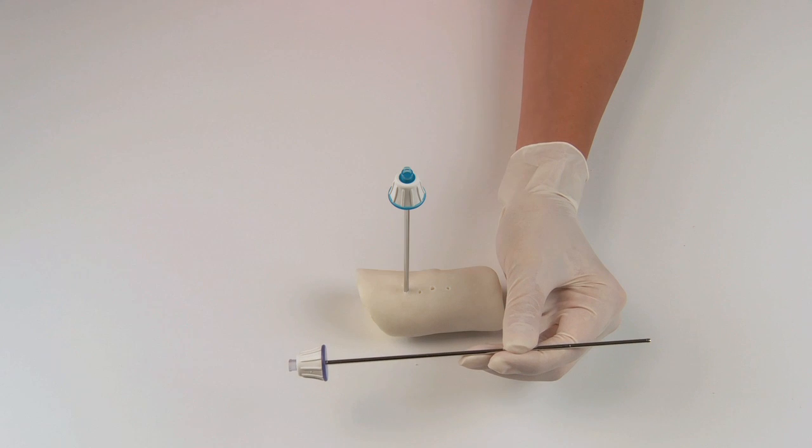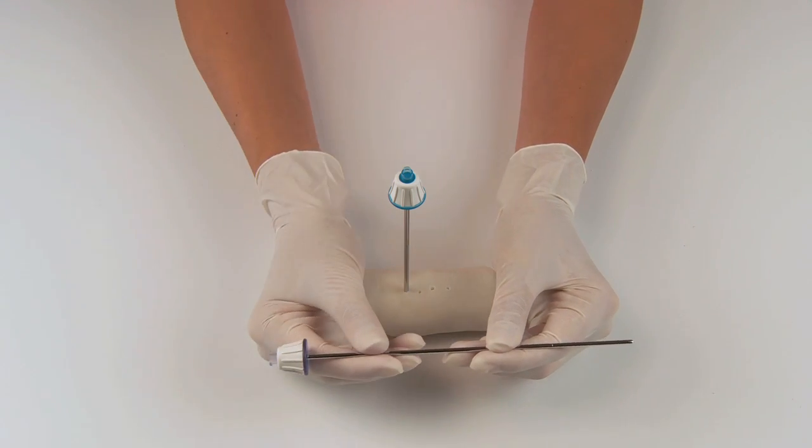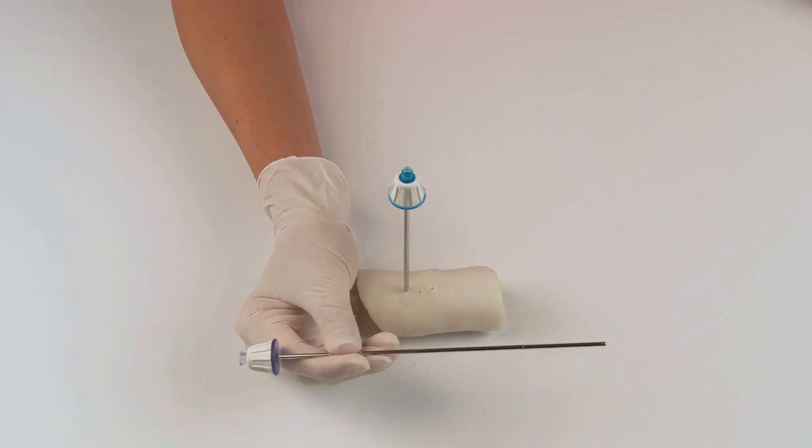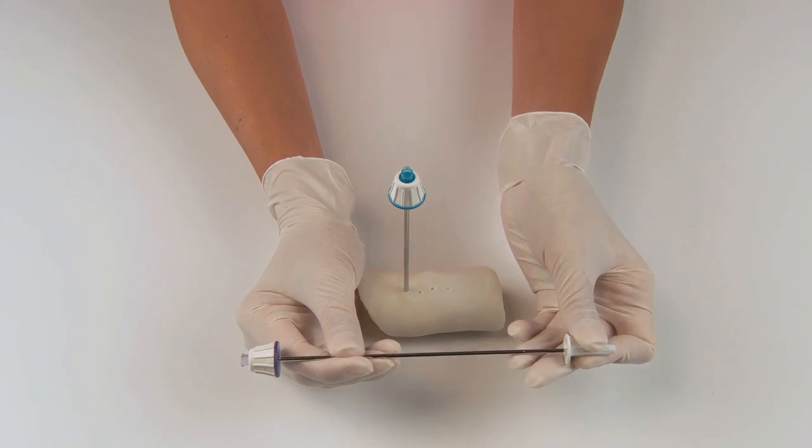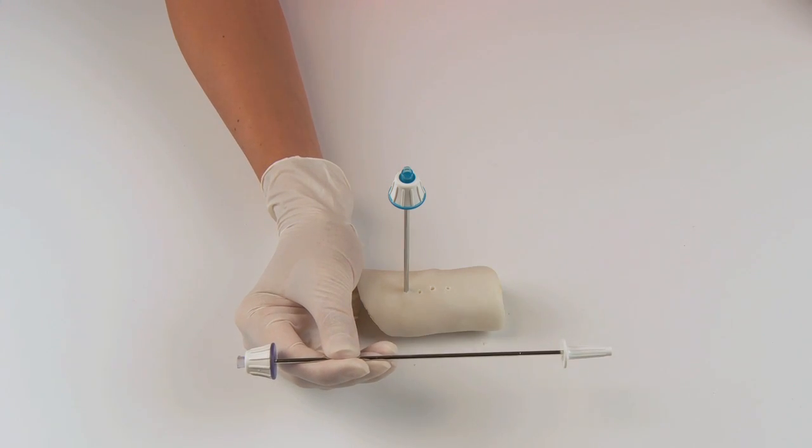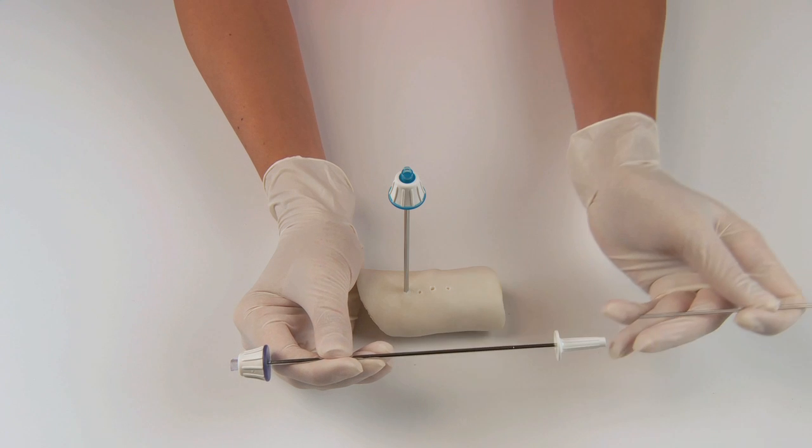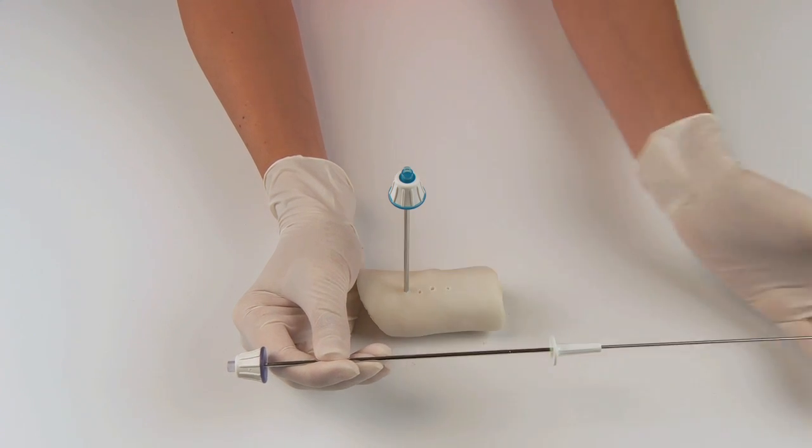Remove the core lock. In order to obtain the sample, place the sample ejector guide funnel on the distal tip of the biopsy cannula. Now insert the shepherd hook ejector pin and push the sample out.